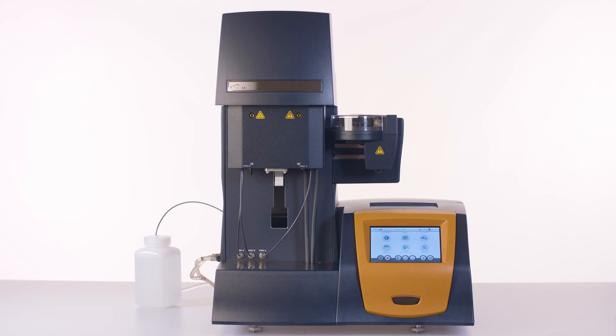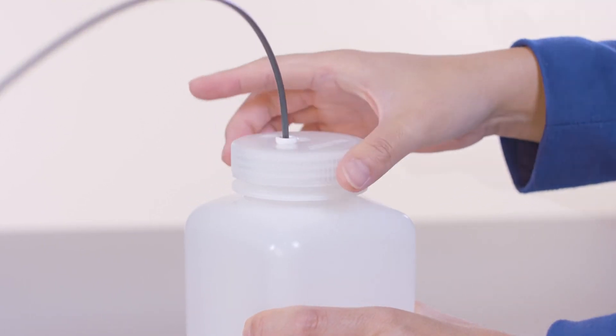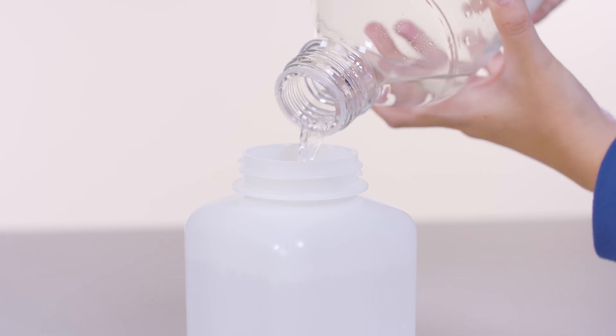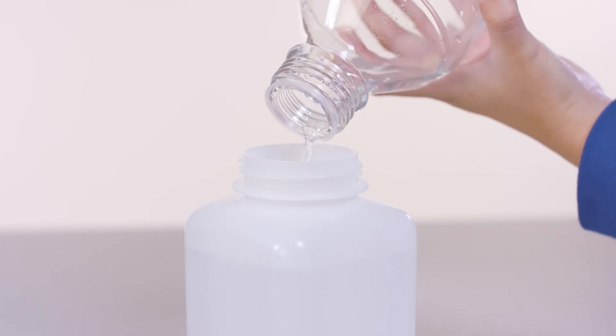If the water level is full, the supplement pump automatically keeps the humidity chamber full. Make sure that the saturated reservoir bottle is full at the beginning of the test. If needed, distilled water can be added to the bottle during the test.